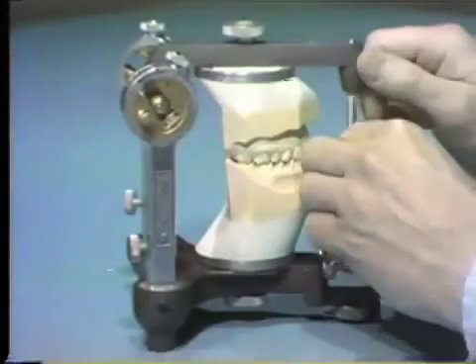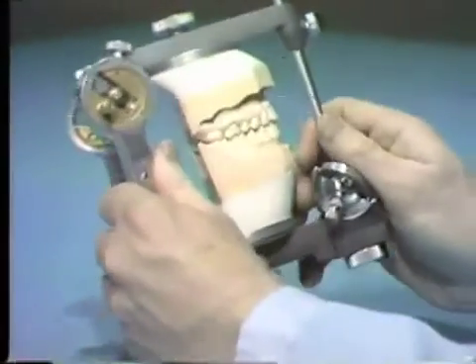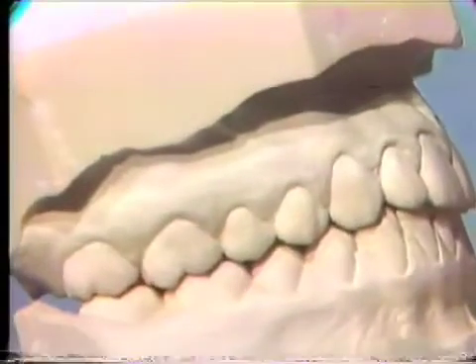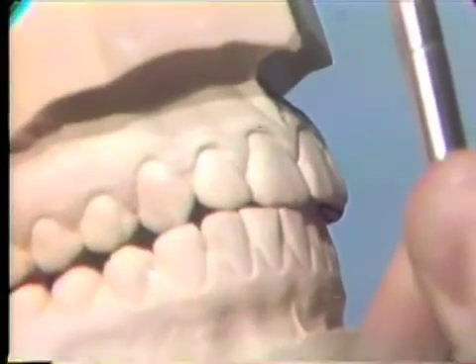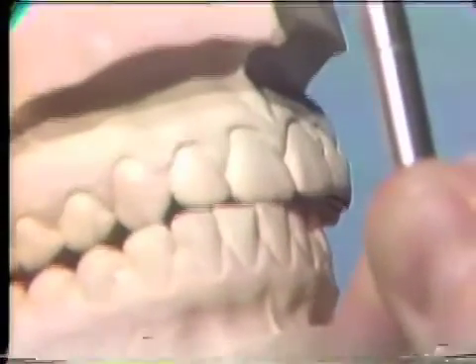The incisal pin should be raised to examine the occlusion during lateral and protrusive excursions. Be very careful when moving the upper member of the articulator to avoid wear on the casts. Move the articulator into right working. The mesiobuccal cusp of the maxillary first molar moves between the buccal cusps of the mandibular first molar. The distal buccal cusp of the maxillary first molar contacts the mandibular first molar initially, then moves between the distal buccal and distal cusps. This contact should not be replaced during the waxing exercise since heavy contact would be an interference preventing cuspid guidance.